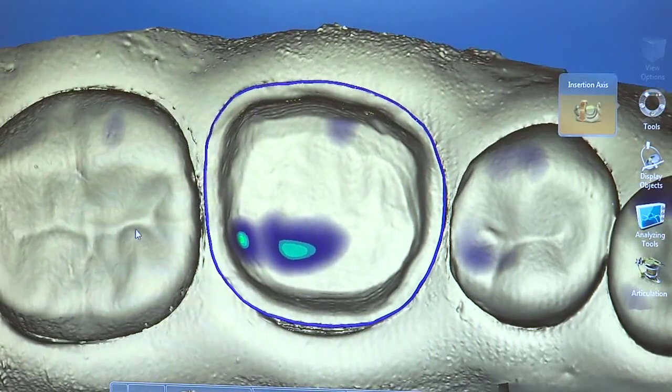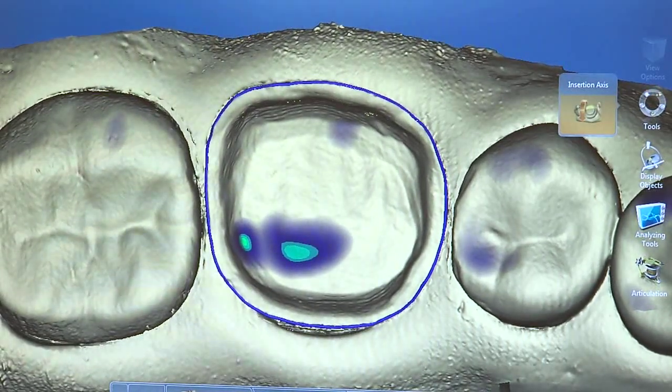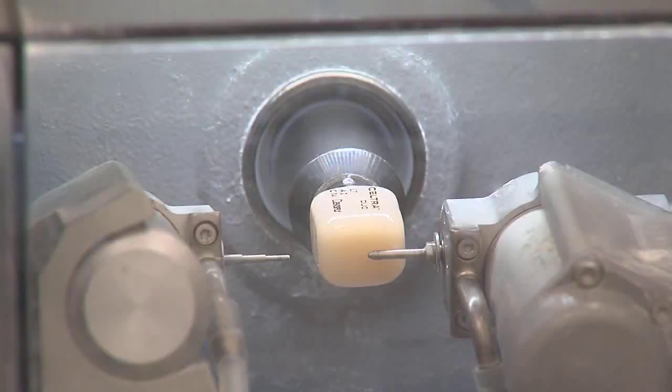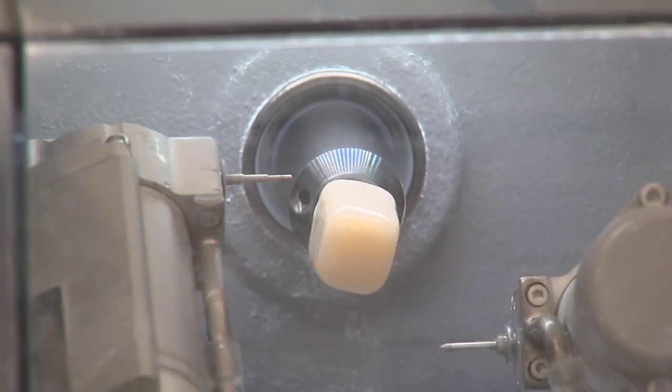Now the computer is designing a crown based on the specifications that we set — mainly what tooth we're doing and where those margins are. It has a computer database of what this tooth should look like, and it's trying to fit that design into the space that we've provided. Everything is good, and we can move on to the milling process.